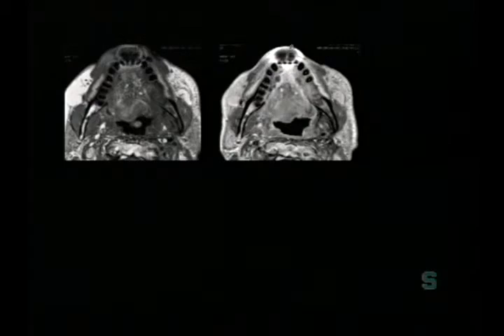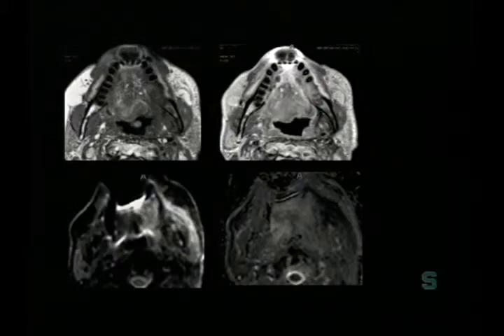And, you know, I can stare at this all day just based on the standard MR, and I can't really distinguish the two because I've seen radiation changes look exactly the same. But in this particular case, when we looked at our ADC values, we can see it's very low.